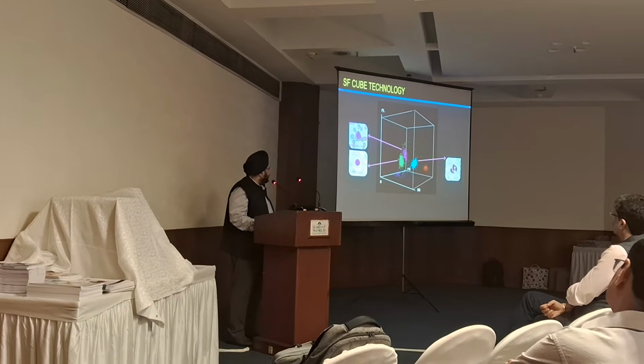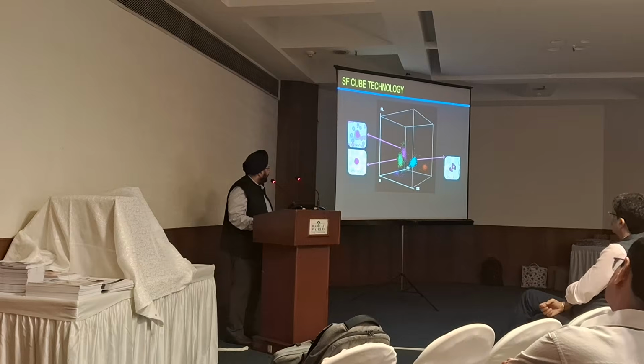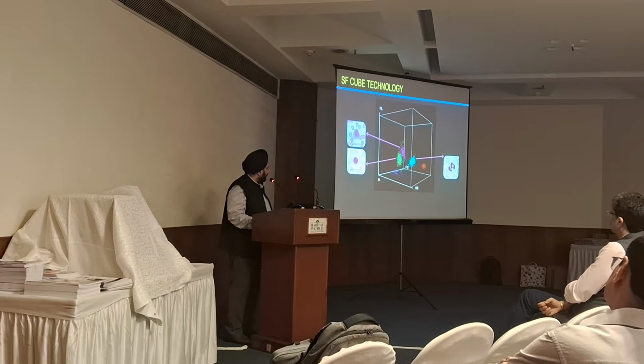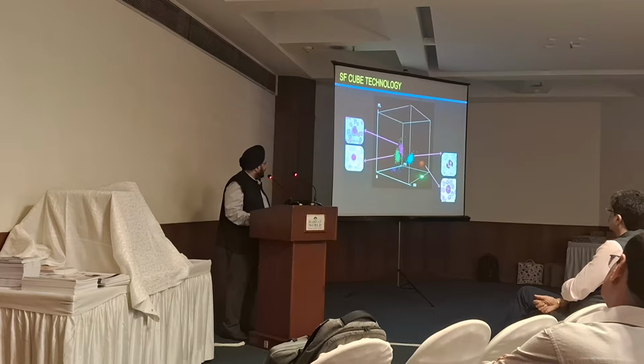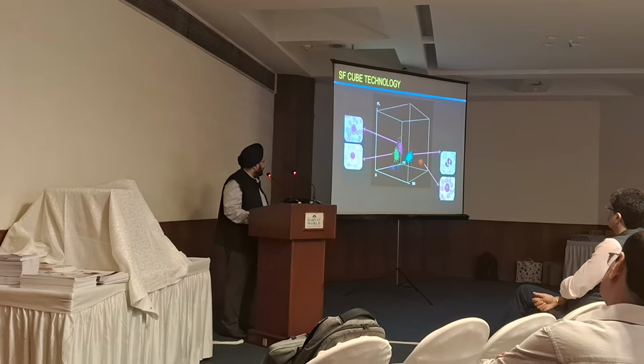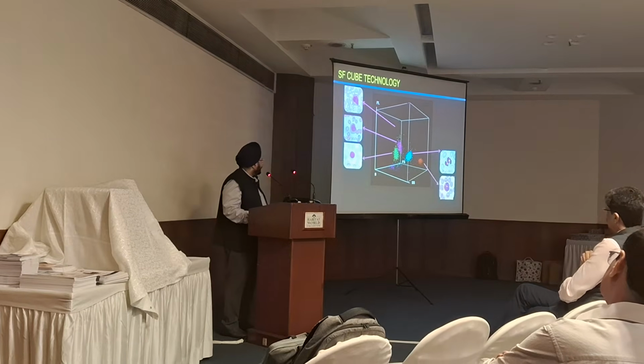This area in the middle is the area of the neutrophil and basophil, which have more granularity than the previous cell line. And this area on the right extreme is the eosinophil, which has the maximum granularity.